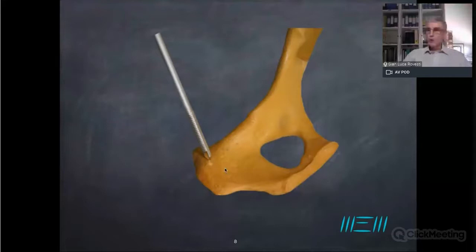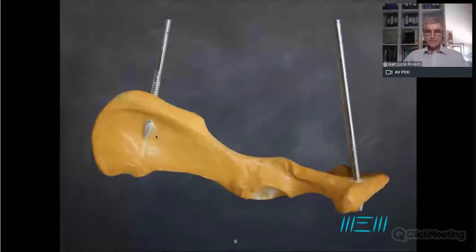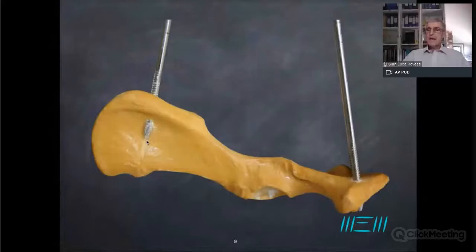So for these two reasons. At the end of the insertion, we will get this kind of stabilization. Since the direction of insertion of the cranial threaded pin, I won't consider any smooth pin, okay? So to me, it doesn't make any sense to use smooth pins for this kind of fixation, as any other kind of external fixation. So when I'm dealing with external fixation, I always refer to threaded pin, and specific threaded pins that are not trocar tipped. The tip is not trocar.